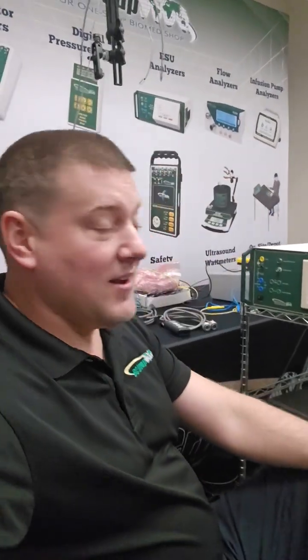What's up everyone, welcome back to Better Biomed. I'm in St. Louis, Missouri at BC Group, and this Friday we're going to be doing ESU training. I'm setting up right now, and it's kind of exciting because I've never had access to this amount of resources all in one spot.